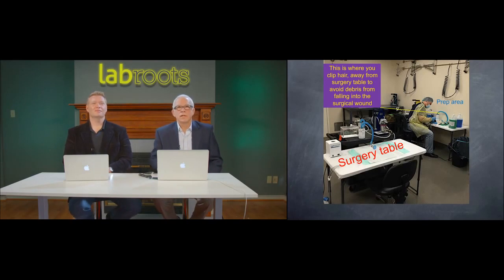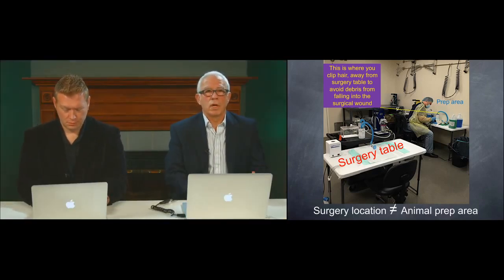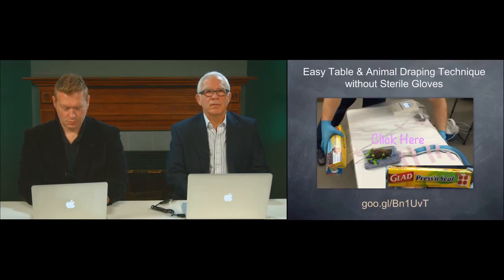Right here you can see that Mitch has moved away from the surgery table so he can clip the animals away from the surgery table. So he is counting on a separation in the lab to be able to minimize contamination right there where the surgery table is. And better yet, an improvement to this would even be if you could clip and prep the animals away from the surgery table, or actually do it in another room. So we are going to give this a smiley face.